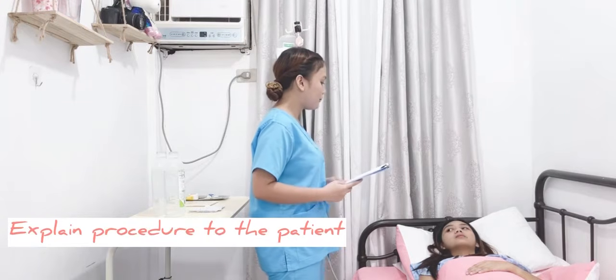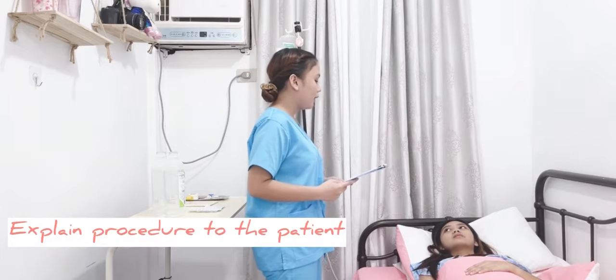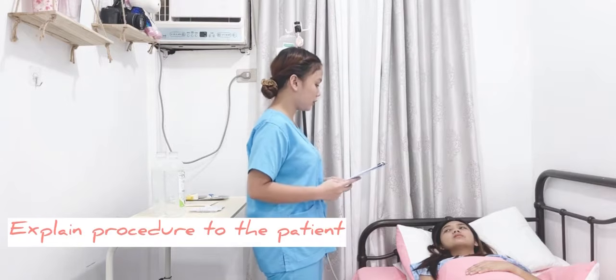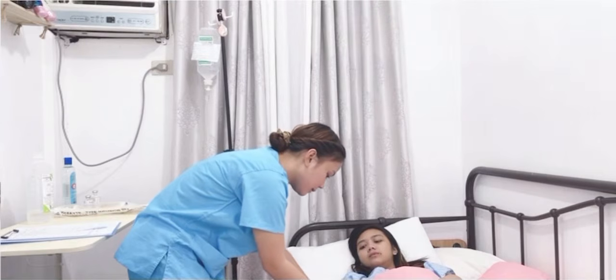So ngayon po ma'am, may administer po ako or may bibigay po ako sa inyong gamot mamaya. Para po yun ma-prevent po yung dehydration po ninyo. Okay lang po ba yun? Opo. Next is to assess IV site for redness, swelling, and pain.